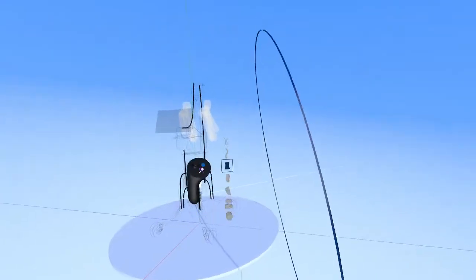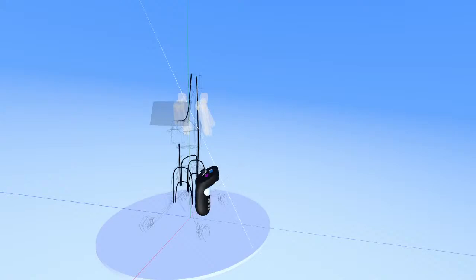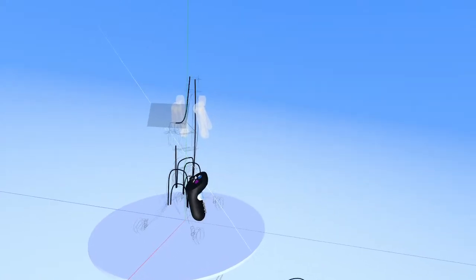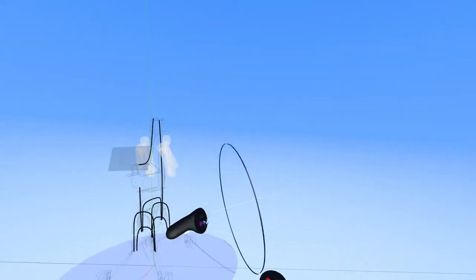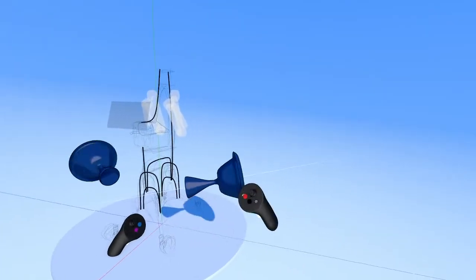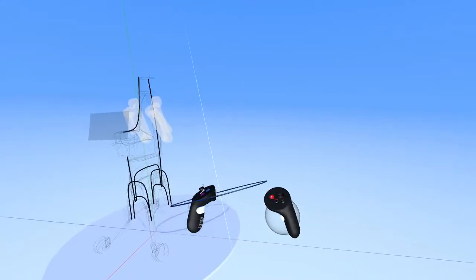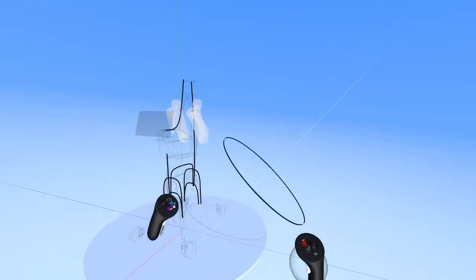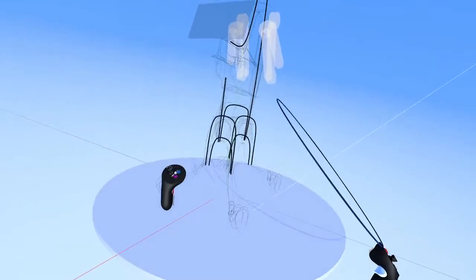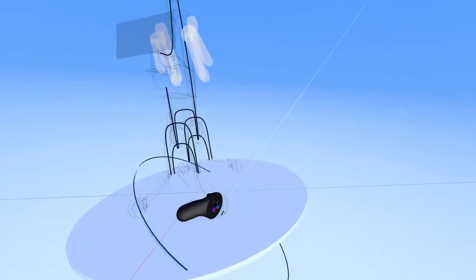Okay, so you've selected the revolve tool here, and you can place it by holding in the pointer finger trigger on the left hand controller. When you let go, you've made a selection and you can start sketching, right? So this is great for freely placing the axes anywhere and starting to make some shapes. But we're doing industrial design and we need a little more precision, and we want this to be snapped along an axis.